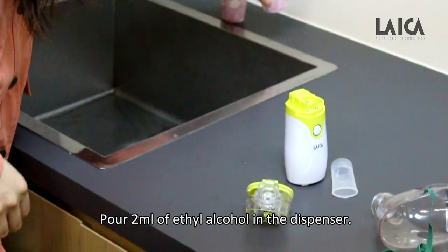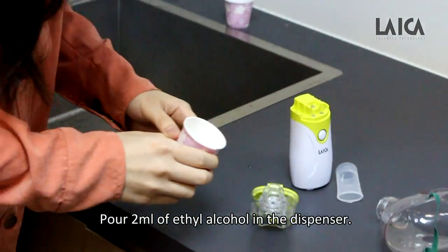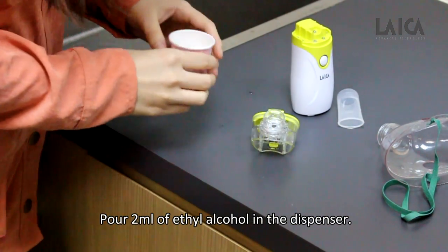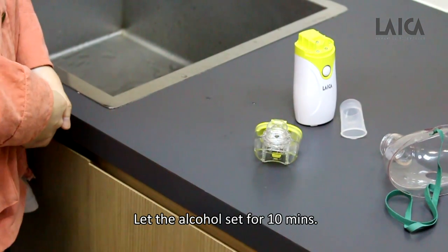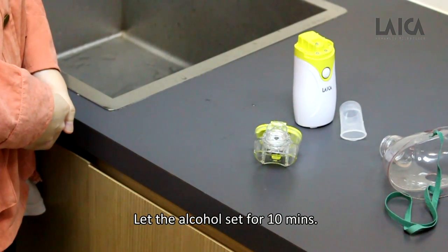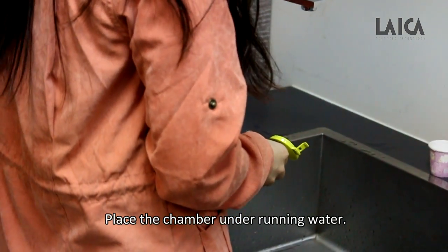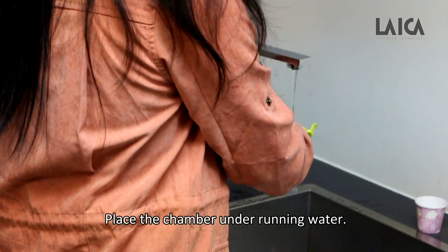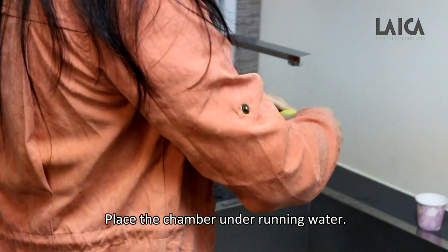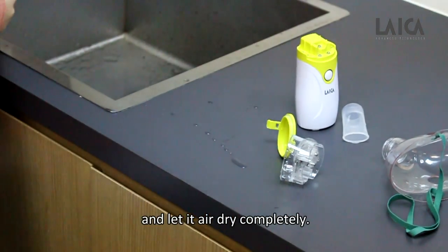Pour 2 ml of ethyl alcohol in the dispenser and let the alcohol soak for 10 minutes. Then place the chamber under running water and let it air dry completely.